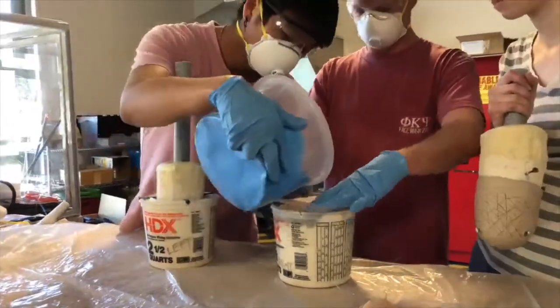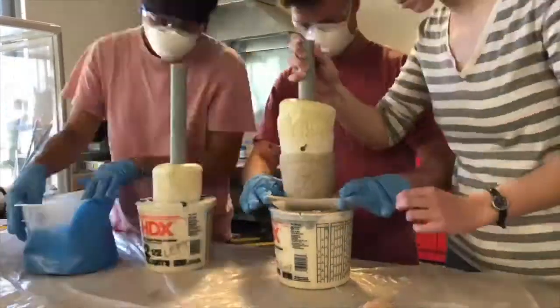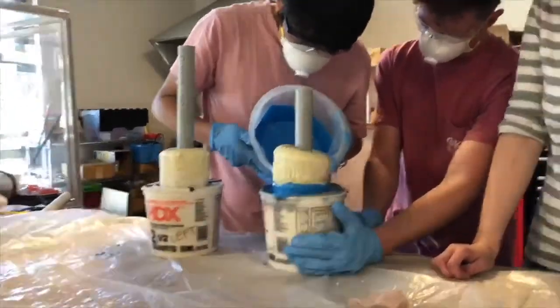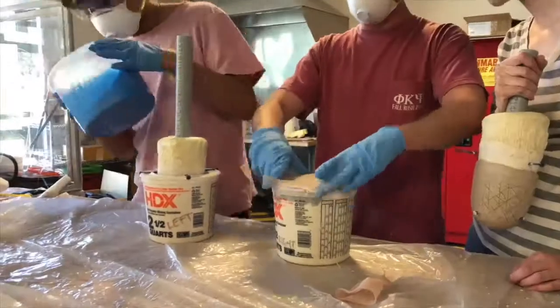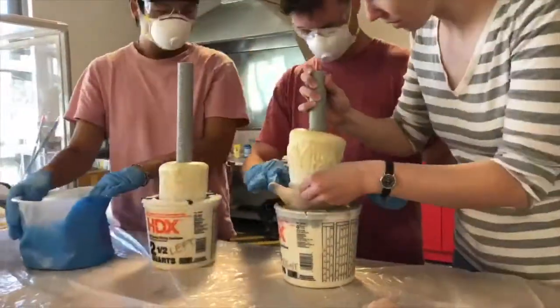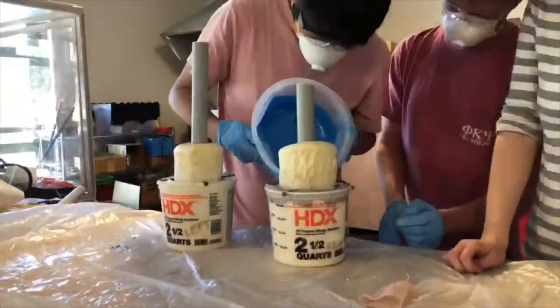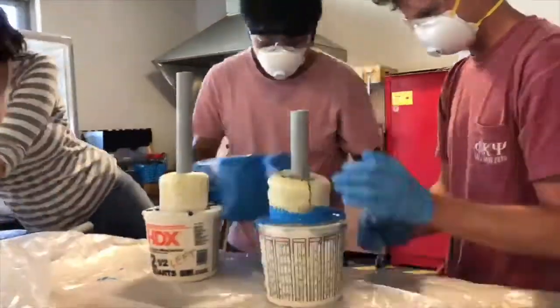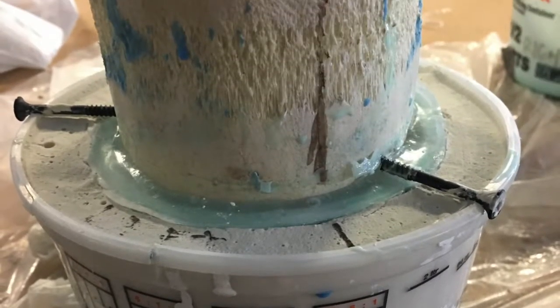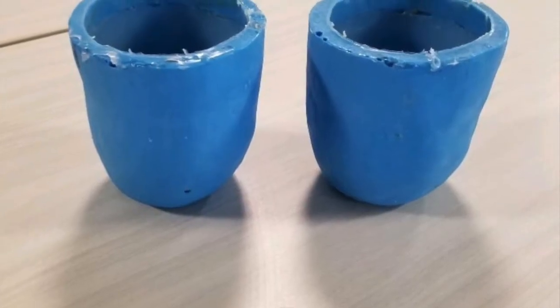After removing the residual from the plaster, we added a thin layer of clay to hold space for the inner layer while we poured the outer layer of silicone. We then removed the thin layer of clay and poured in the inner layer. This is the final prototype we sent Jeremy!